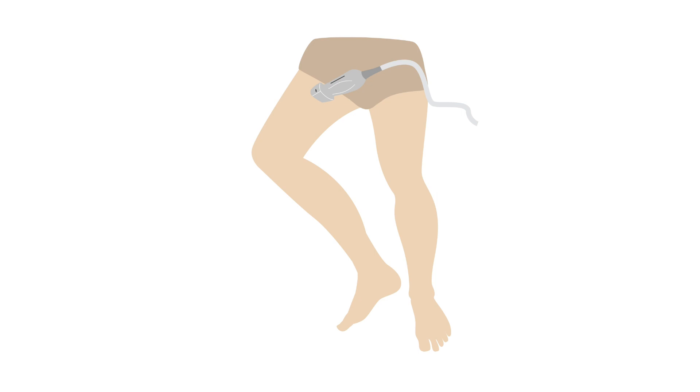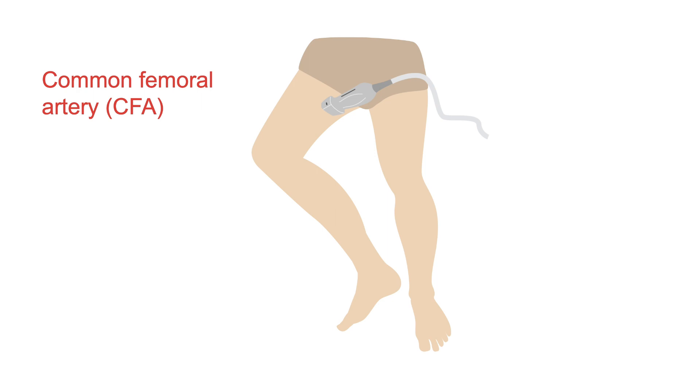Begin in the right inguinal crease, which is the natural crease in the groin just below the inguinal ligament. Start slightly on the lateral side and slide the probe medially. You will cross the common femoral artery, or CFA, and the common femoral vein, or CFV.